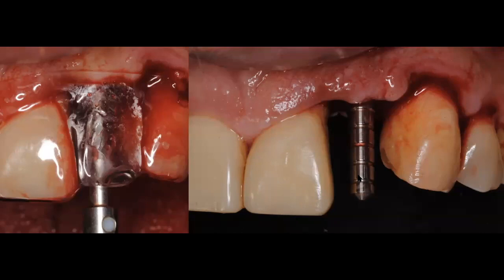And again, this is a really good technique for these single implant surgical procedures that you're going to be performing in your practice. And I know that the great majority of patients that you're going to have initially in your practice are going to need a single implant. So this single implant surgical technique or surgical stent is a really good, inexpensive, simplified way of doing it in your office.